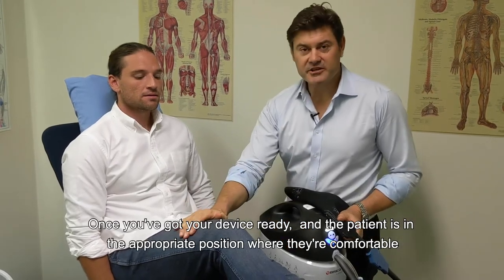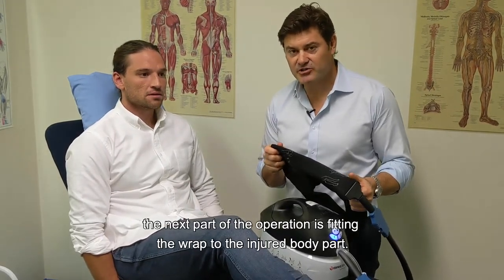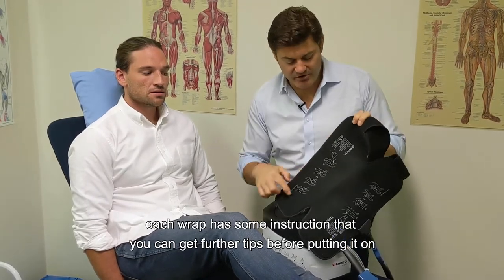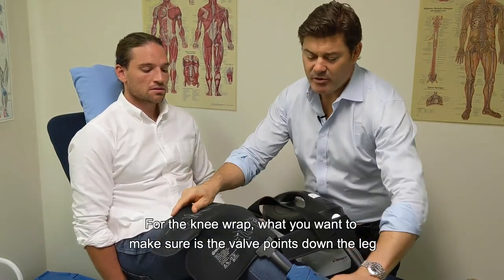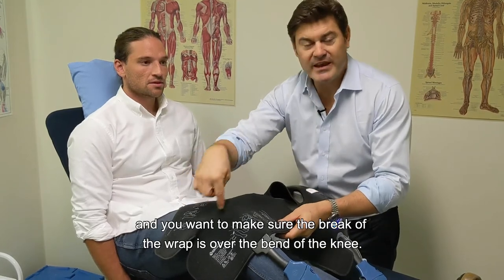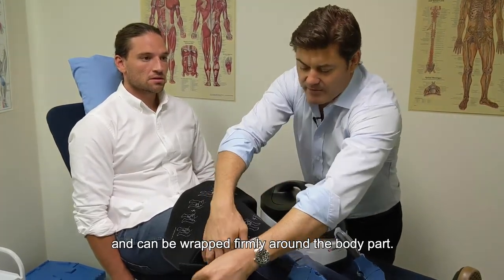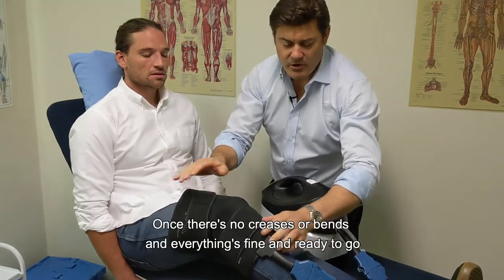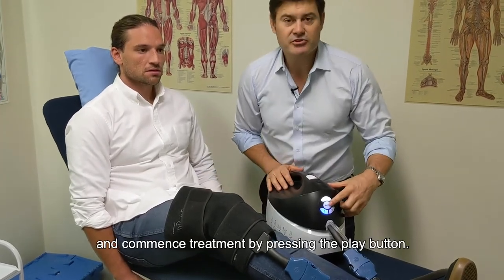Once your device is ready and your patient is comfortable, the next step is fitting the wrap to the injured body part. In this episode we have a knee wrap — each wrap includes instructions for additional guidance. For the knee wrap, make sure the valve points down the leg and that the break in the wrap sits over the bend of the knee. Ensure all velcro is out of the way, wrap it firmly around the body part, and once there are no creases or issues, come back to the machine and press play to commence treatment.